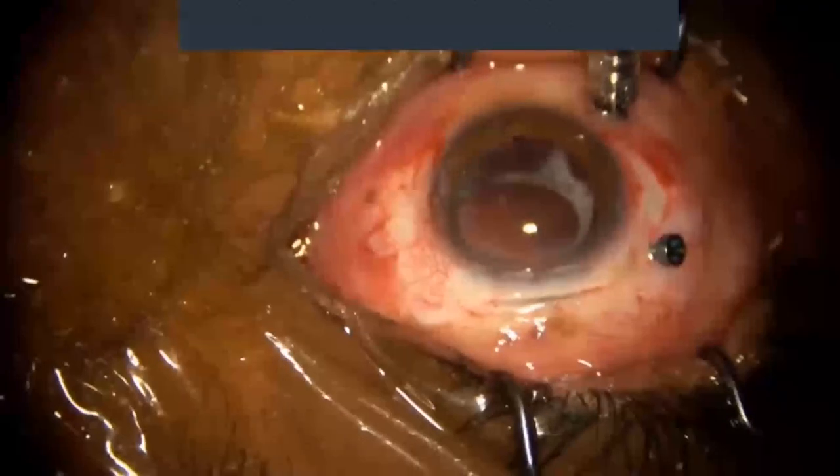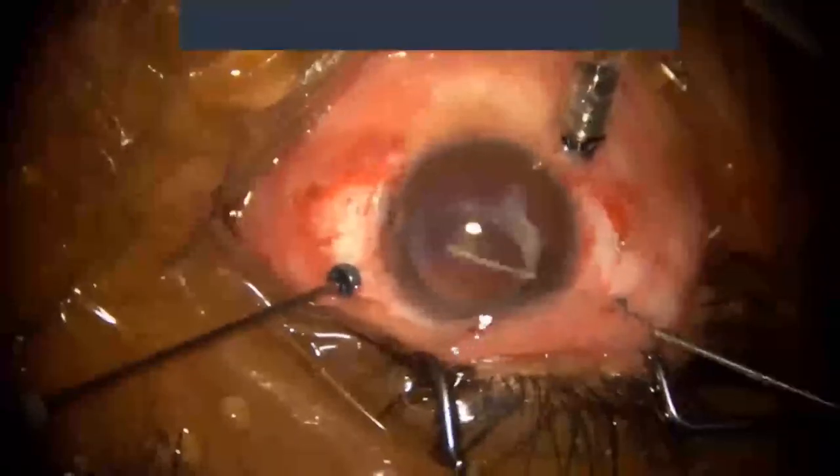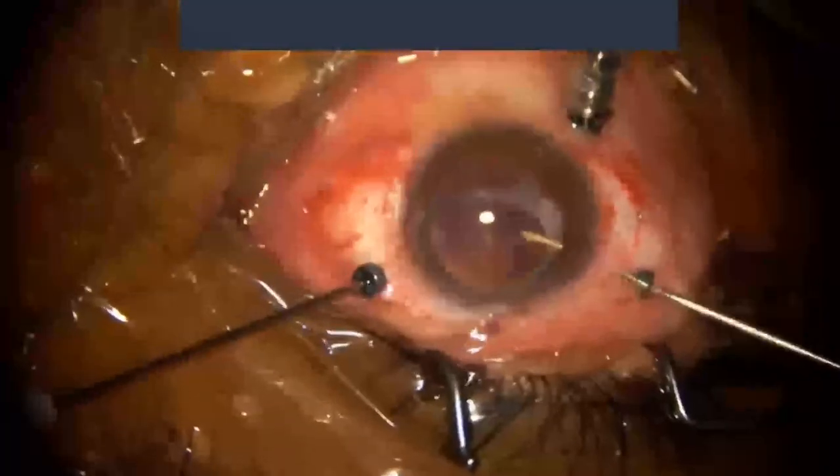Three standard 23 gauge pars plana ports were made. Infusion cannula was checked and started. Anterior vitrectomy was done. Core vitrectomy was done, and as we continued the posterior vitrectomy, all the while watching out for any intraocular lens in the vitreous cavity. We injected perfluorooctane to protect the macula and to help in levitation of the lens.